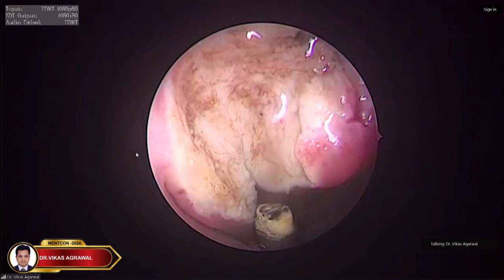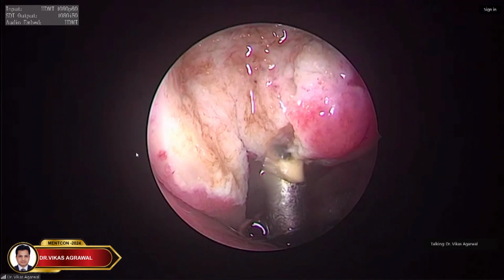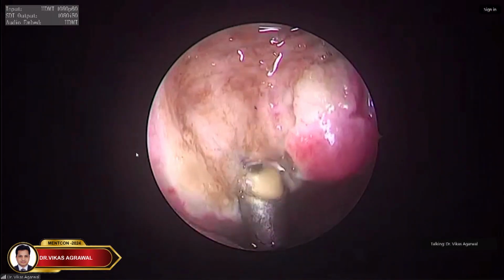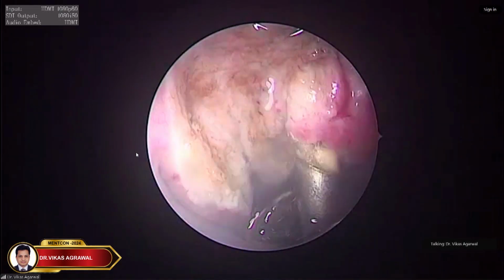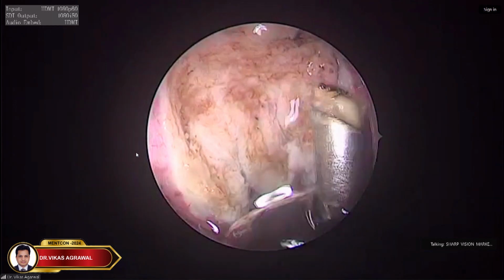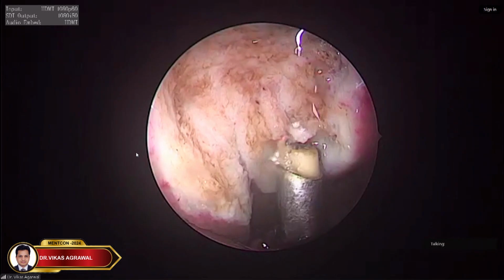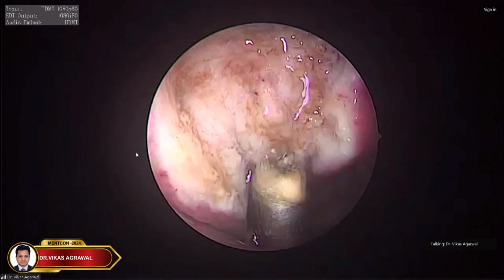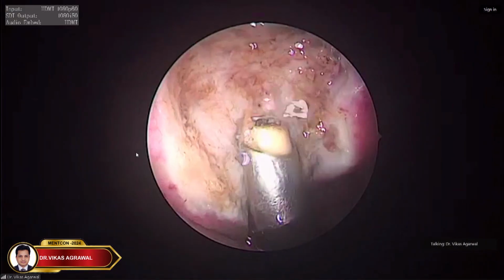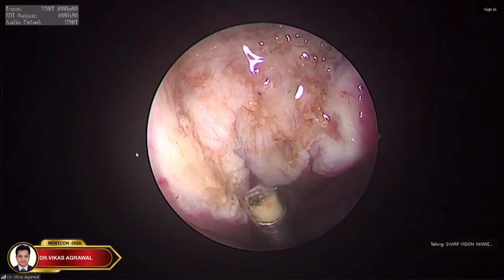All right? So just as we do for mastoid, and you see it's full of vessels, right? But you don't need to bother. You keep on working. I have not used coagulation so far. I was just going to ask you, do you stop and use coagulation or you just keep cutting? No, I did not. You saw. In fact, I'll try to make it bleed once again. If I work fast, it might bleed. I'll try to show you a bleed, only for demonstration. If it bleeds, it bleeds.